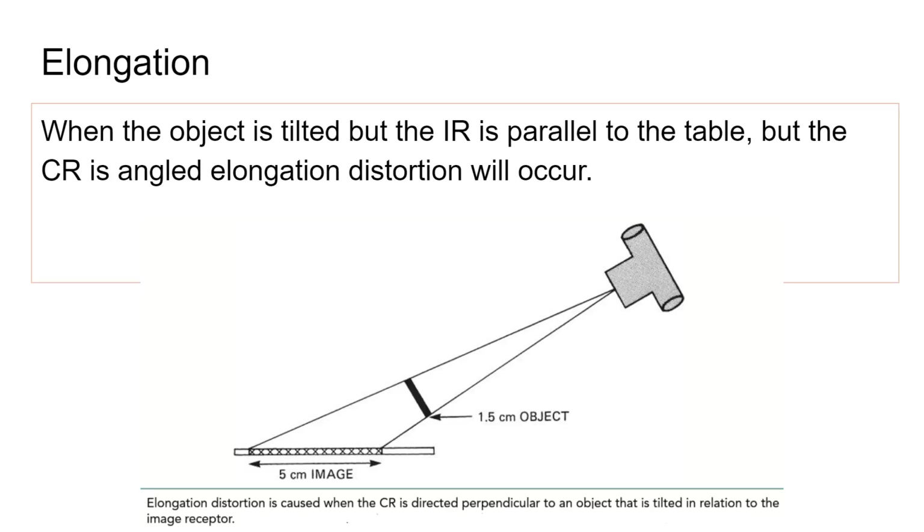Why should we take more x-rays? But then again, it's school, and none of them have ever said no to me, because it is a learning environment. But every time that happens to me, and it hasn't happened in a while, I'm always torn to ask the student to additionally irradiate the patient.